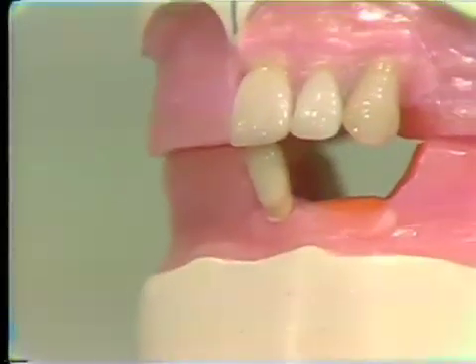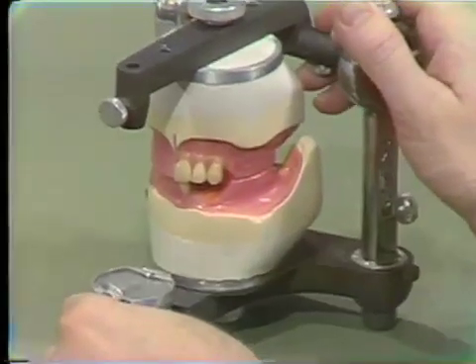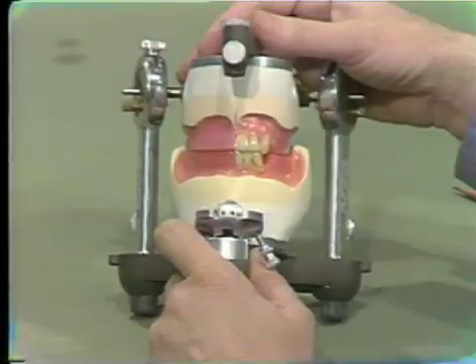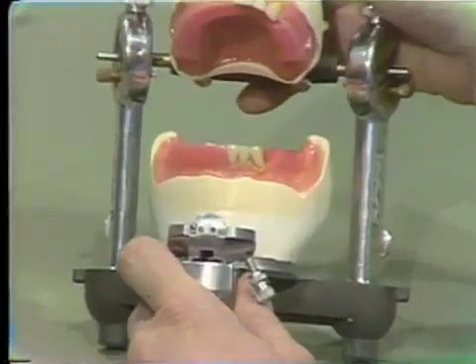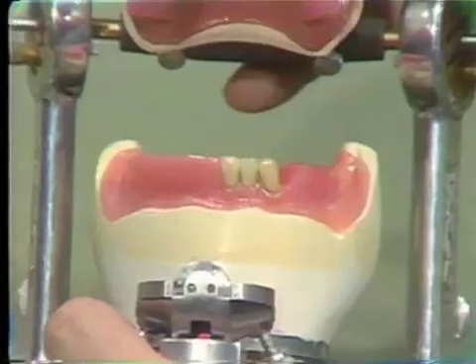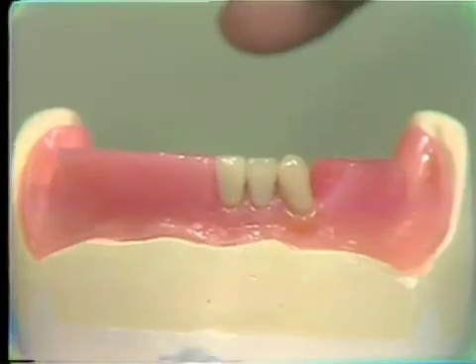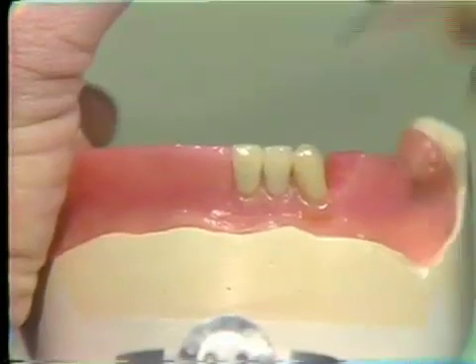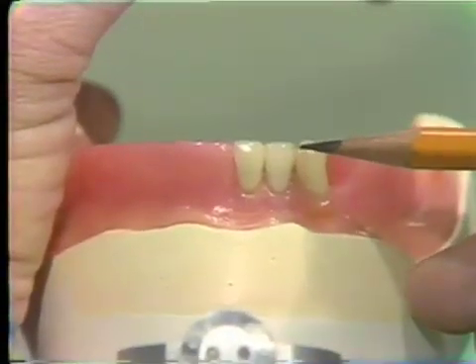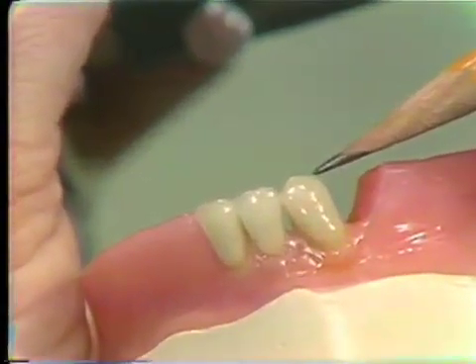And at this time, using the same guidelines, I'm going to go ahead and set the lateral and the lower cuspid. Now I have gone ahead and set the lateral incisor and the lower cuspid. And at this time you'll notice again the incisal edge of the lateral incisor is even with the occlusal plane. Now the cuspid tip may be slightly above the plane, but you'll notice that the incisal portion in the mesial and the distal is just at or below the plane.